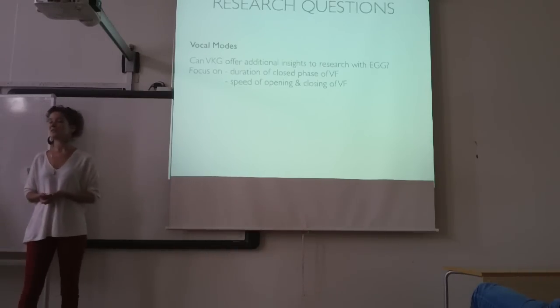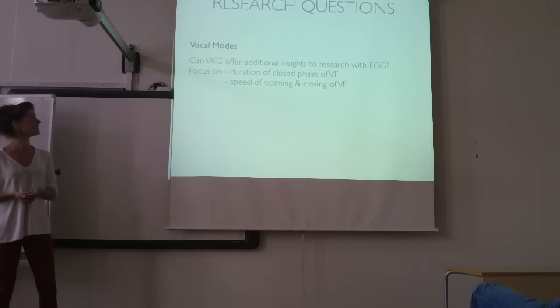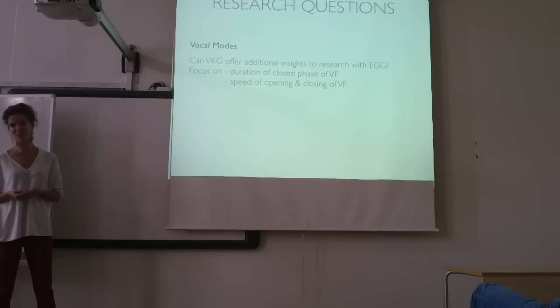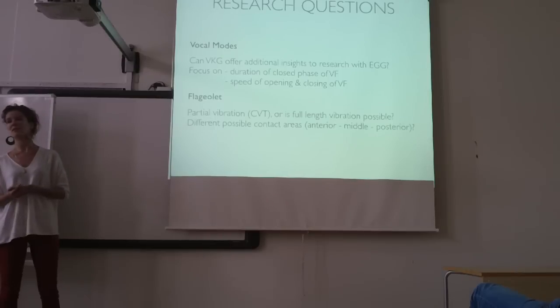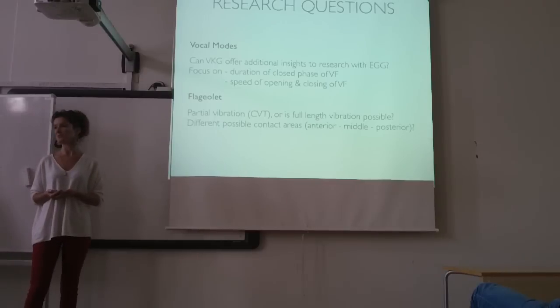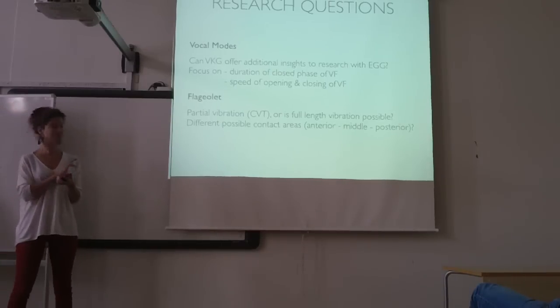First of all, we wondered whether videokymography could add some additional insights to research with EGG. Although we could see so many things, enough for 10 lifetimes, on the footage, we decided to focus on the duration of the closed and the open phase of the vocal folds, and also the speed of the opening and closing. Concerning flageolet, we wondered whether we would see partial vibration as being stated by CVT, or whether full length vibration would also be possible. And we have looked at the different possible contact areas, meaning anteriorly, the front of the vocal folds, the middle of the vocal folds, and posteriorly, which means the back of the vocal folds.